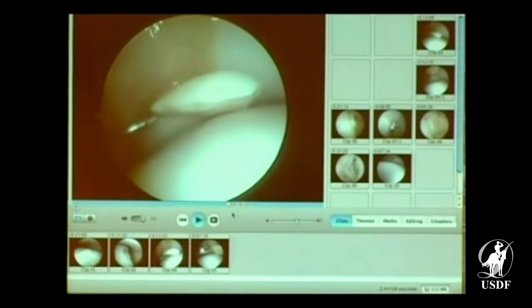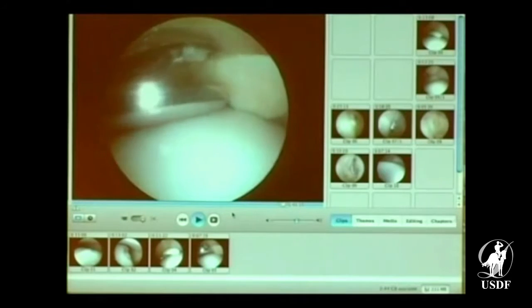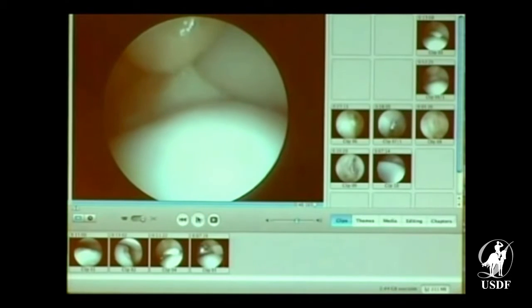It's loose, so that's a needle, and I'm just pushing the needle in saying, okay, that's just a loose fragment hanging around the stifle. That's not a good thing for any horse. In fact, they used to call it a joint mouse because it ran around the joint, but it's not very common. And there we are, just going in there, removing that little thing so that he won't have a problem. Again, doing that at a young age.